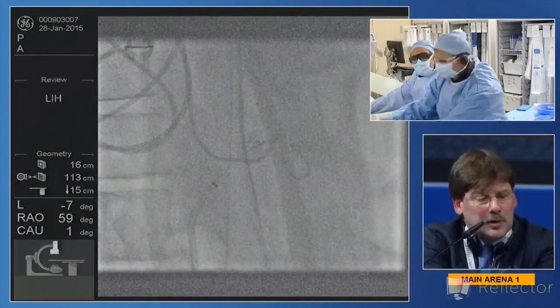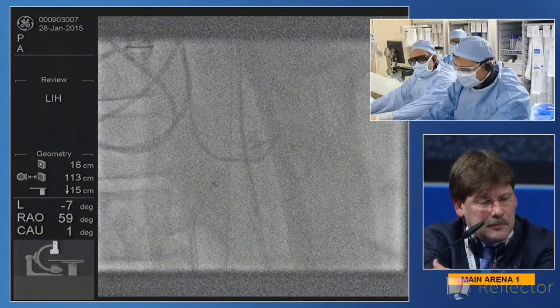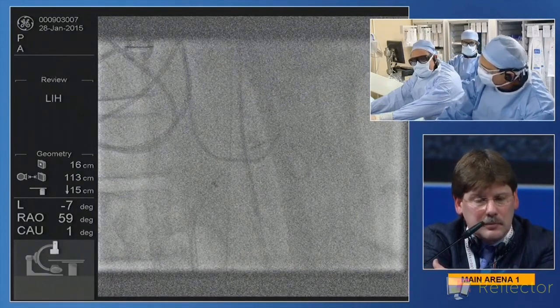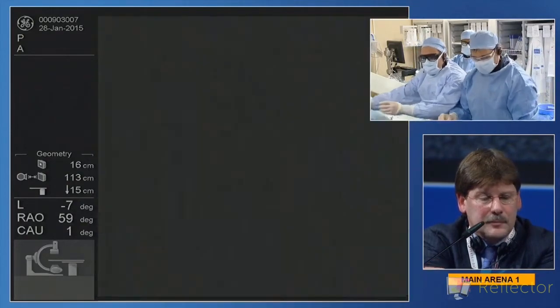So you still got your catheter trapped there. You're going to drop the coils and then just take it out when you're done. Is that right? Exactly. I don't anticipate any problem pulling that out. It's a microcatheter. Let's see how this looks.